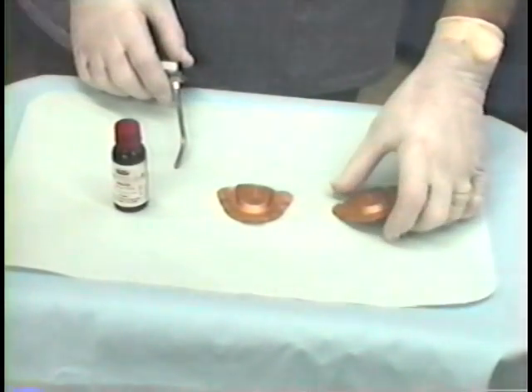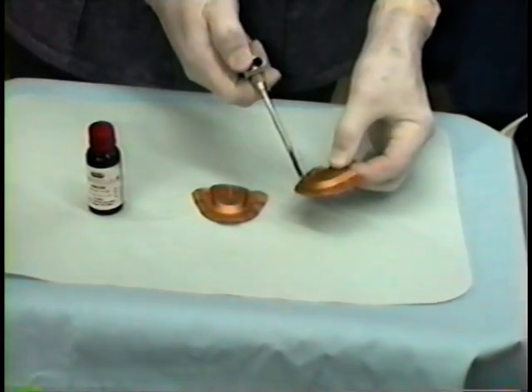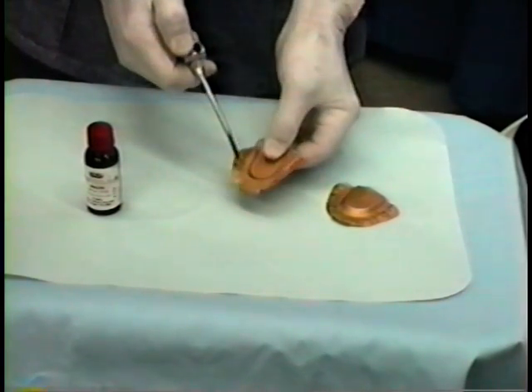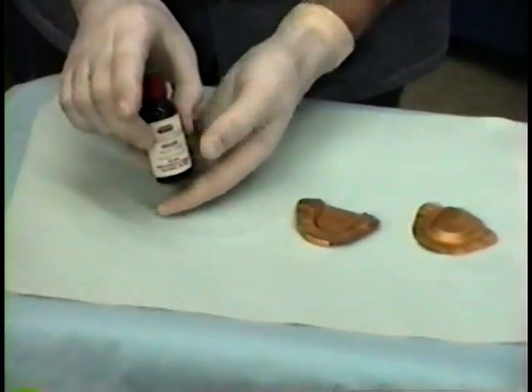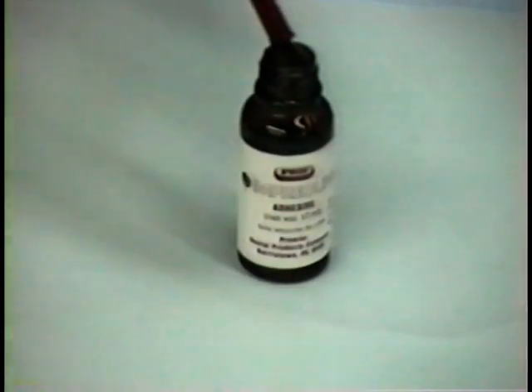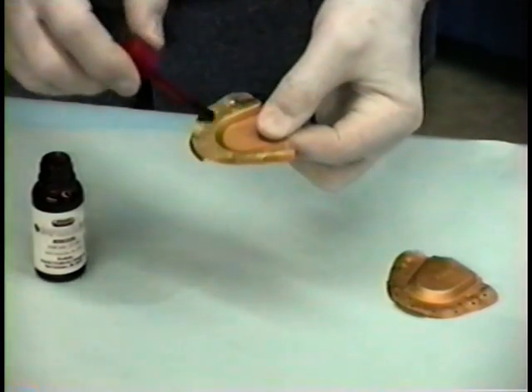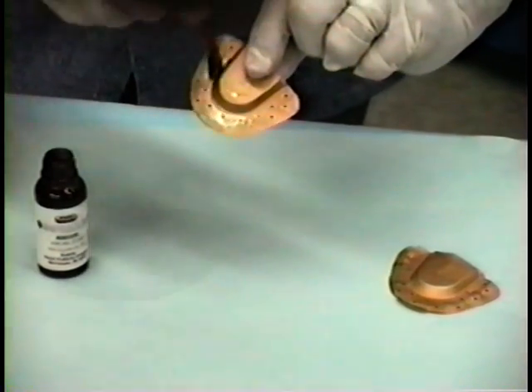After the patient has conformed the trays to the occlusion of the mouth, we must dry the trays on both sides very thoroughly with compressed air. We must put an adhesive on the tray — in this case we're using Empregum adhesive. Grasp the tray in the palatal area and paint the perforated areas of the tray with a light coat of adhesive on both sides.